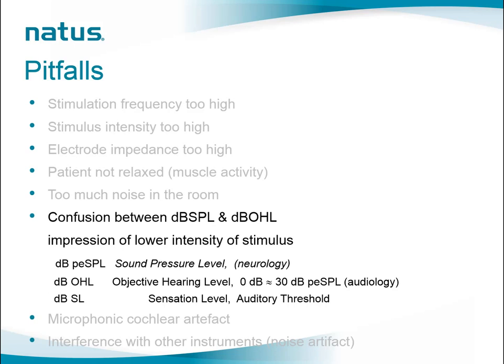Another thing that happens, and that I experience quite regularly, is the confusion that there can be between decibels SPL and decibels OHL. Basically, this happens when I hear somebody telling me, I'm stimulating at that intensity, but the sound, I perceive it as low compared to what I know. So this may be if we make a confusion between applying 90 dBs SPL or 90 dBs OHL.